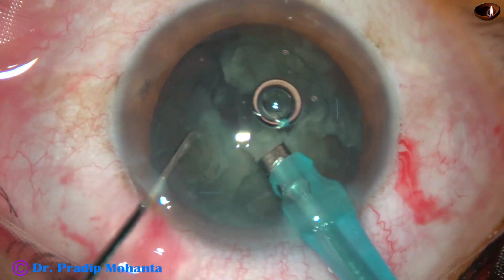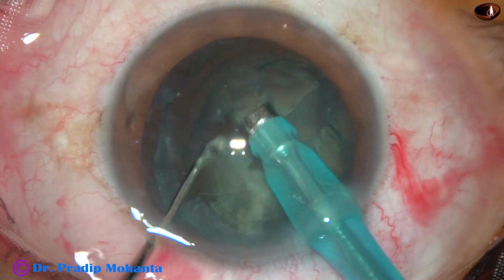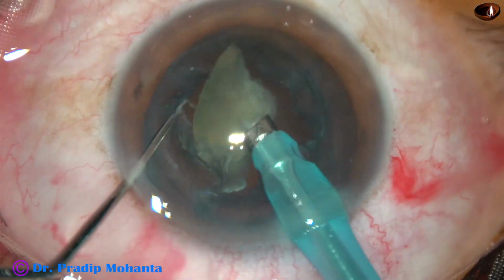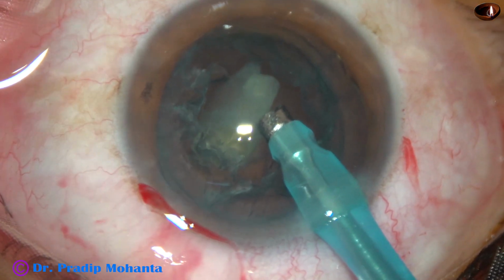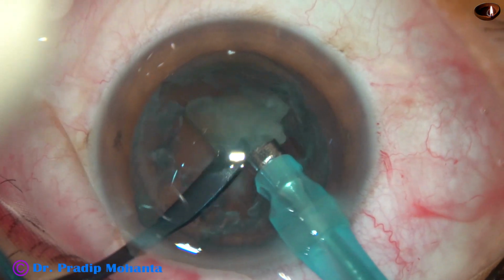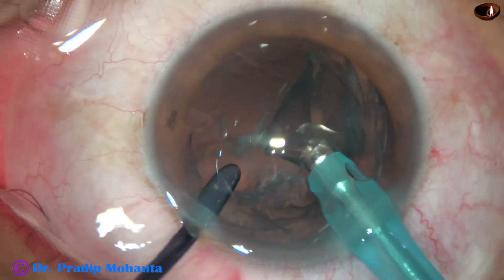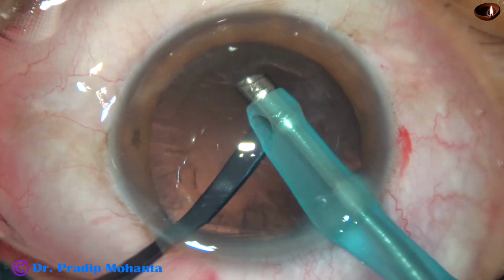The nucleus is being divided into 4 large fragments, and then each fragment is emulsified and eaten up. Since this is a soft cataract, the nuclear fragments can be eaten up without dividing them into smaller pieces. And this is an instrument, I call it PCP, posterior capsule protector. The epinucleus and the last piece are emulsified when this instrument protects the posterior capsule.